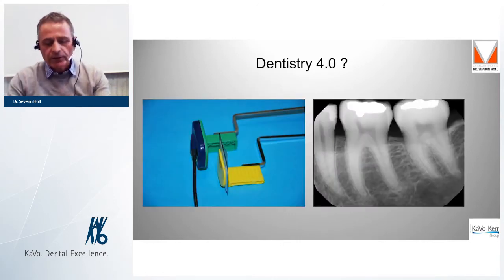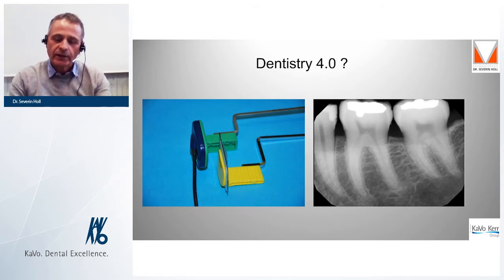When we look at our dental practice today, we realize that in the last 10 years, digitalization has made a massive entry. Let's take a look at the field of X-ray technology. Today, whether it's with sensor or foil technology, we achieve a result that, compared to analog film, is qualitatively better.